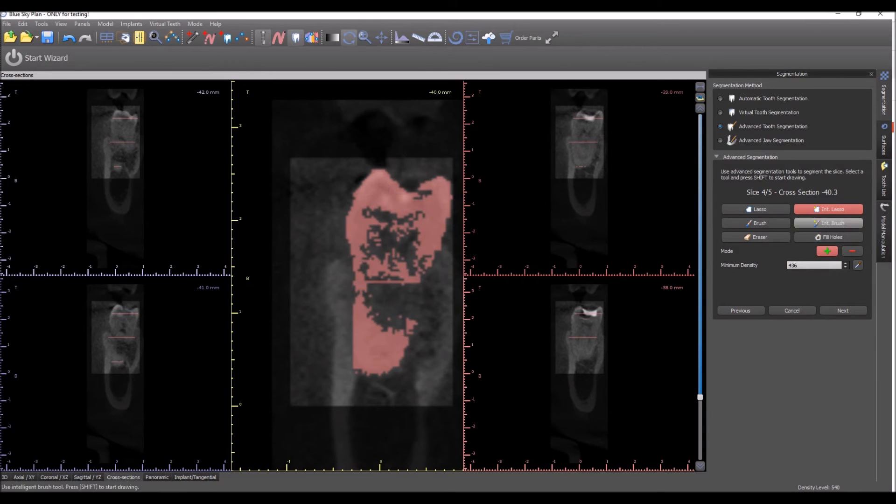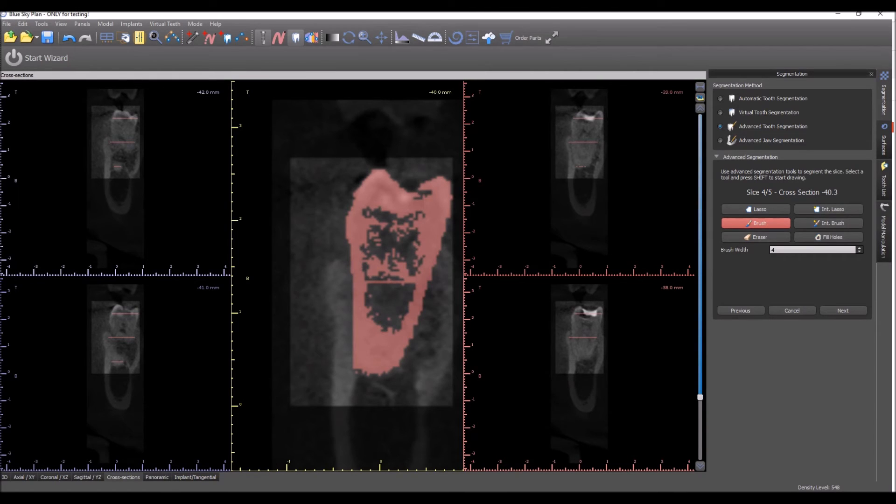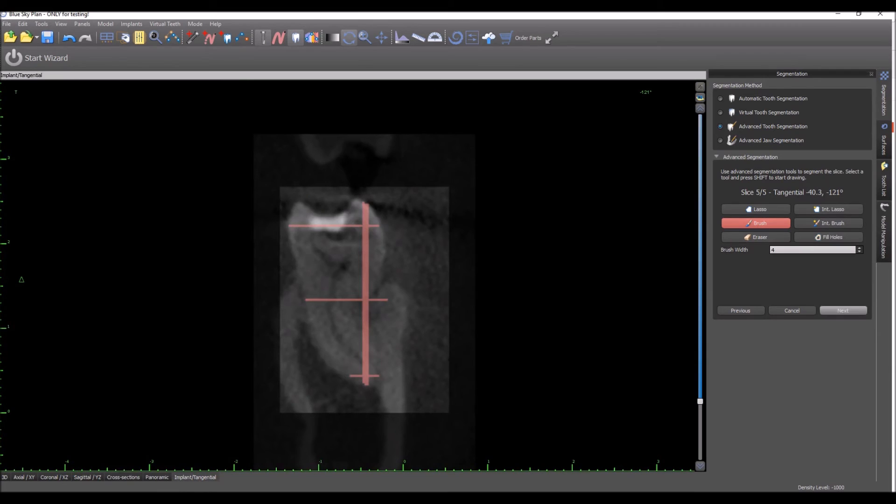Fill the holes. We can also use the Brush to close off sections, and then when we use the Fill Holes, it will fill in everything in the middle. And we're up to our last slice.